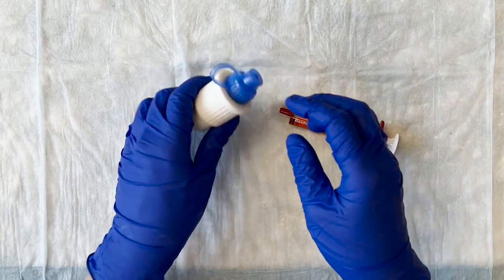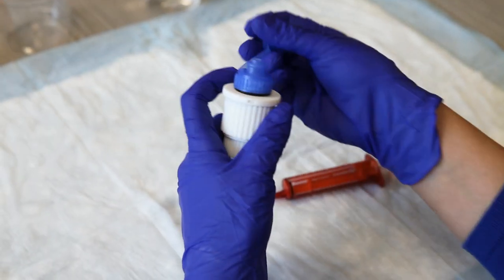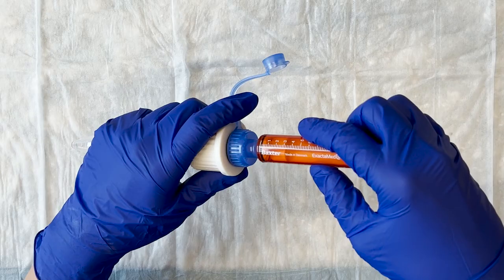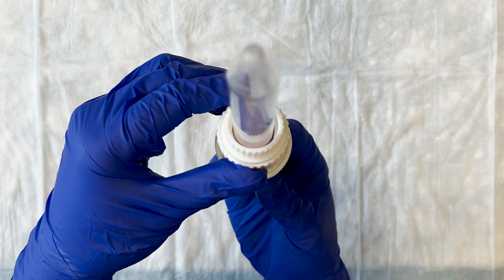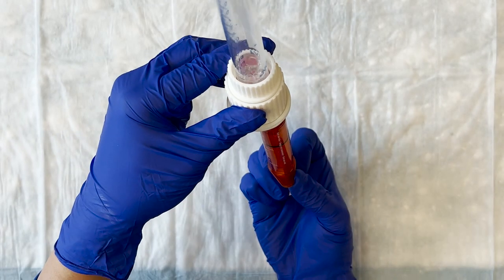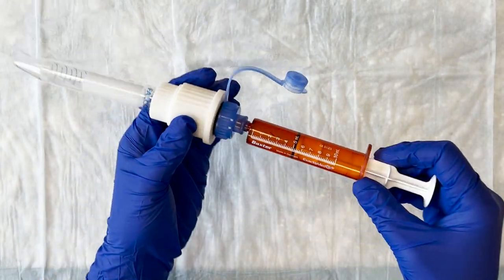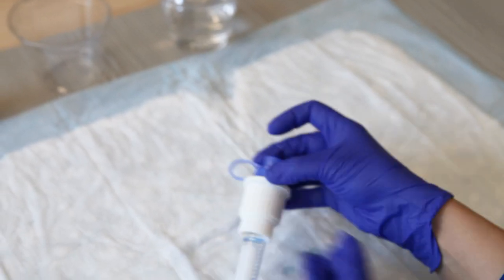Open the pop top on the blue cap of the dissolve and dose device and place the tip of the oral syringe into the blue cap. Lift the dissolve and dose device until it is upright over the oral syringe. Withdraw the appropriate dose using the oral syringe. Your healthcare provider will tell you how much solution to give to your child. Give the medication to your child right away. Never prepare and store the dose ahead of time.